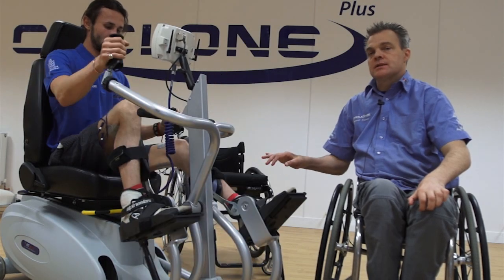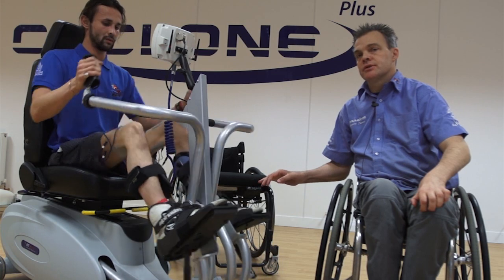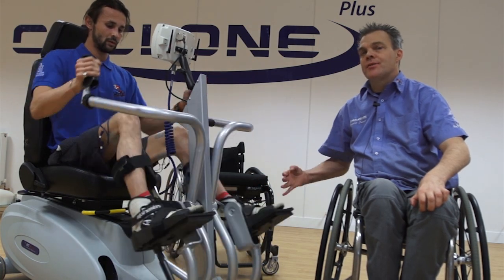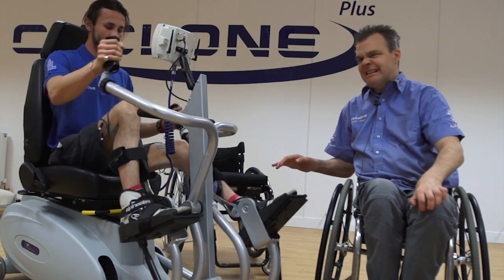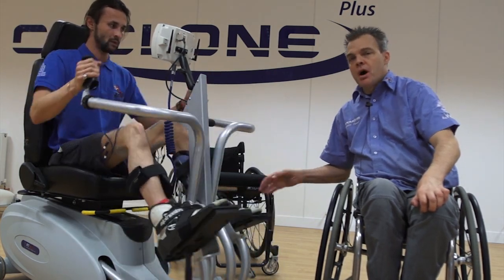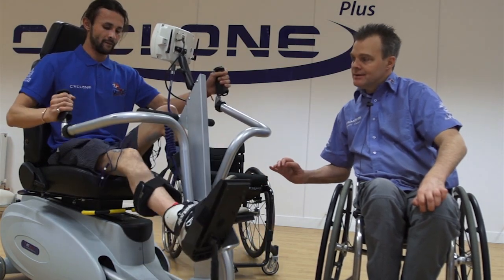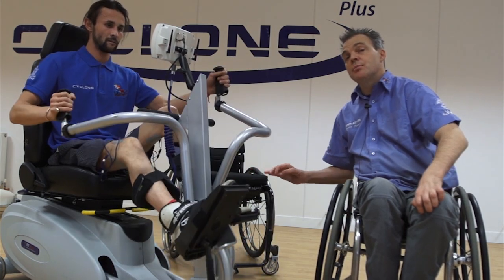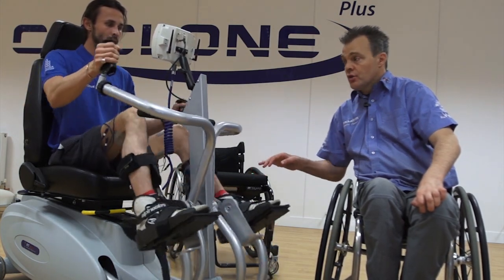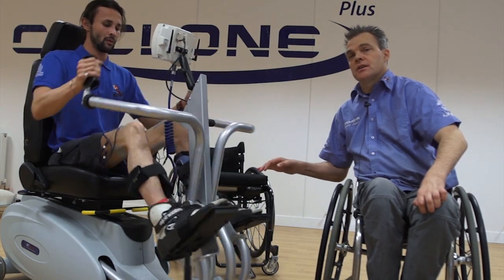Some of the benefits of this system is that we do get people that are not wheelchair users — sitting into a chair to do an exercise is not where they want to go. So people with MS, Parkinson's, or stroke can use this. It's great because somebody that's not a wheelchair user can use it, but somebody that's an independent wheelchair user can also use this as a really good cardiovascular device.